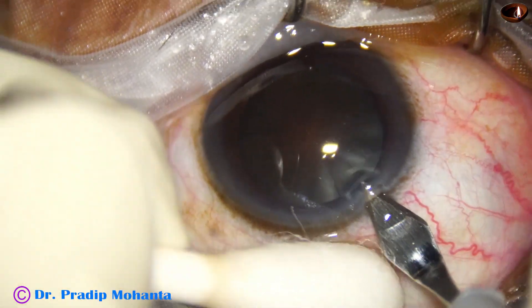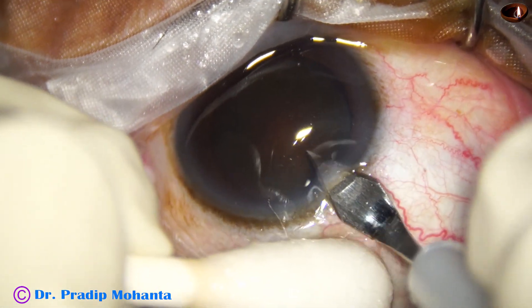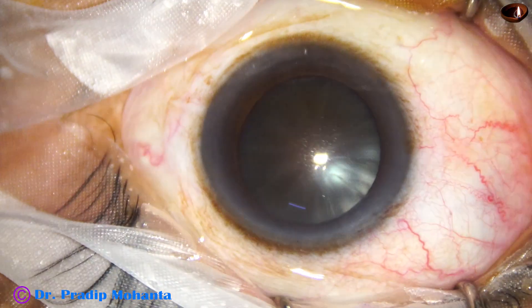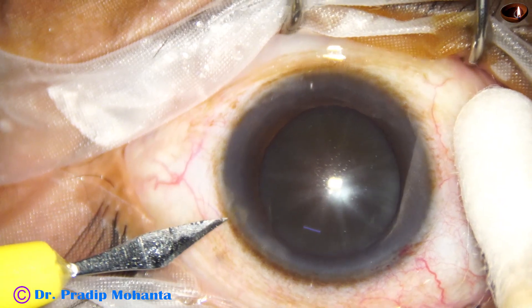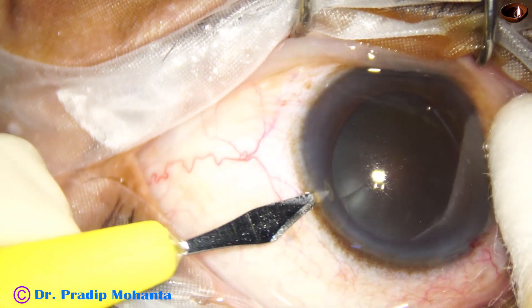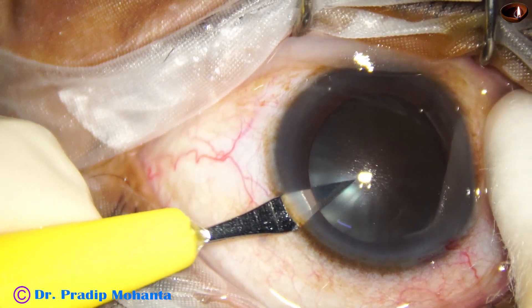This is the main wound made with a 2.8 millimeter steel keratome on the posterior aspect of the limbus, and now a side port is made on the left side of the main incision, about 3 clock hours away.